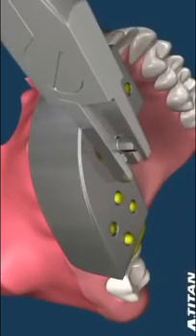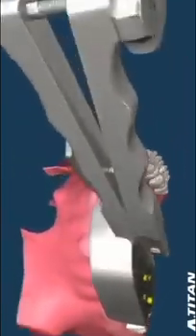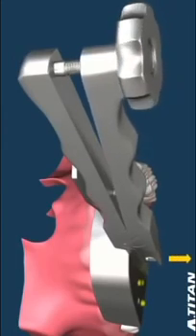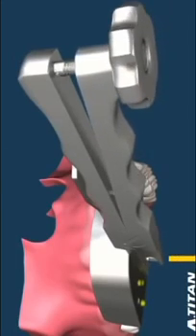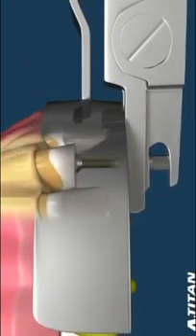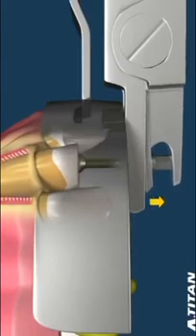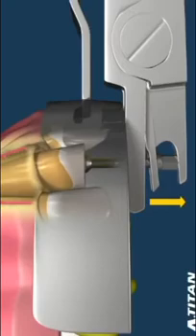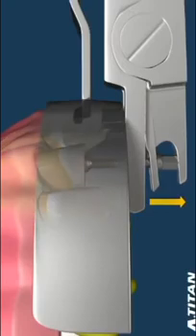The extraction tool is then fitted on the tray and post. By slowly turning the knob on one end of the tool, the instrument lifts the post and the attached tooth with only a vertical force. As it lifts the tooth from the socket, it breaks the periodontal ligament that keeps the tooth in the socket.